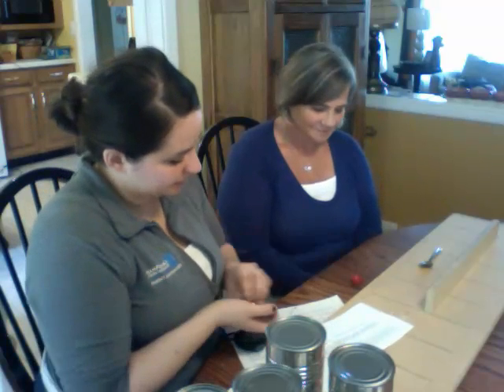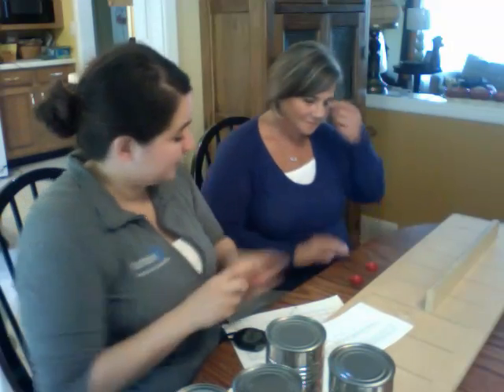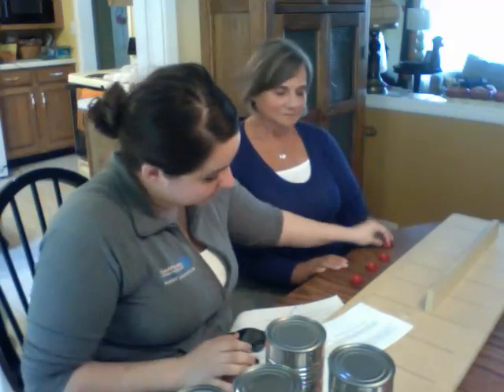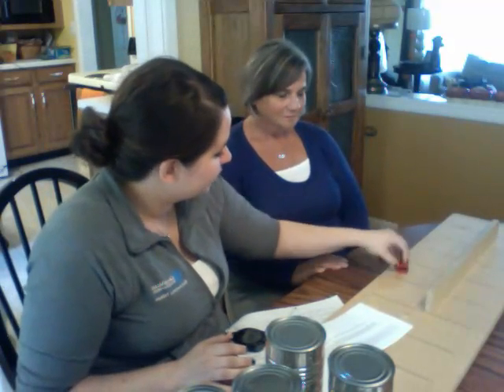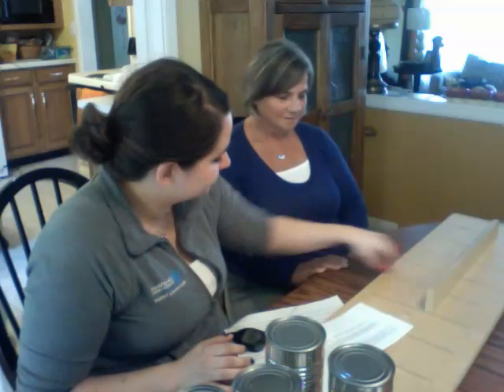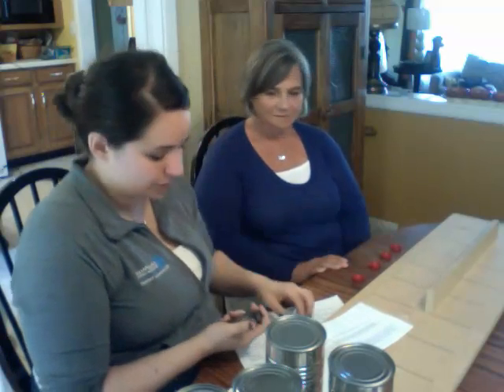So next we are going to play checkers, but not the way that you learned. So I'm going to place these in front of you, and you're going to place your left hand on the table. And when I say go, you're going to stack these checkers using your left hand on the board in front of you as fast as you can. Which I know you know, but just like that, okay? Do you understand? Yes, I do. All right. And you can begin with this one with any checker. Okay. So, ready? Go.